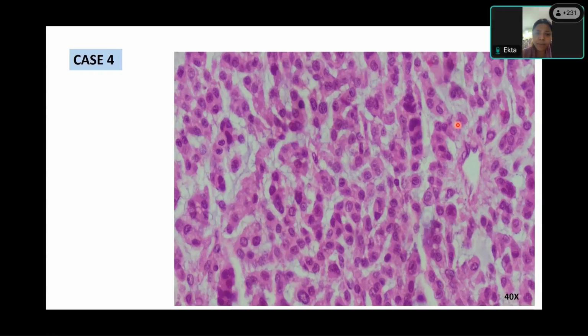Any glioma? Ependymoma. Okay, ependymoma. Something like a myxopapillary ependymoma, which has a very characteristic site. Okay, anything else? In a myxopapillary ependymoma, do you get cords of cells like this? Yes, you get abundant myxoid material in the background. Okay, so any other? Okay, so what IHC would you like to order?